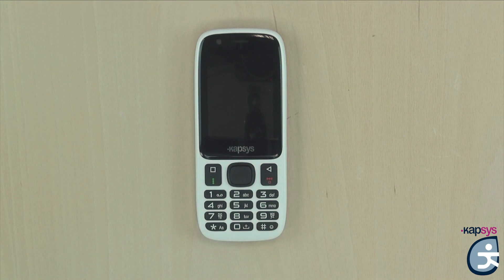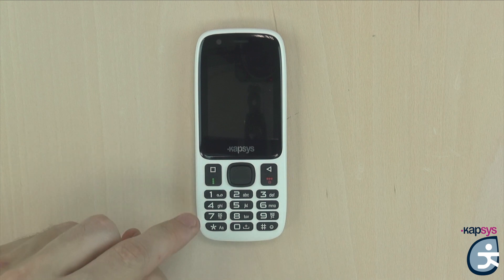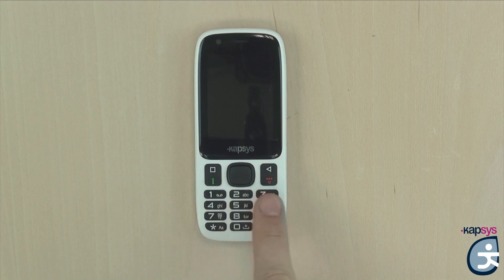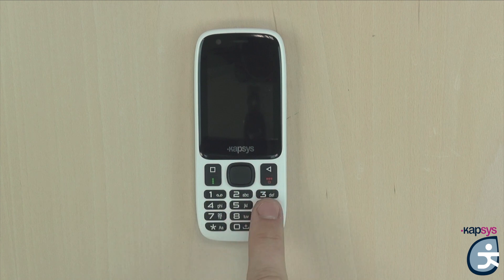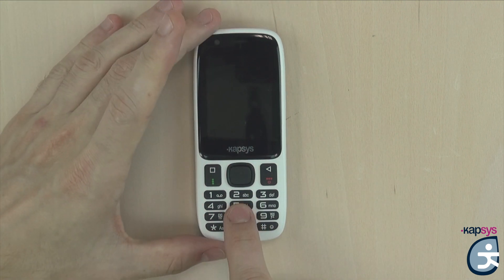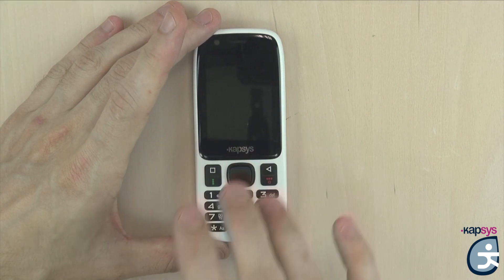Below the screen, you have the physical keyboard, which is composed of two parts. On the lower part, you have the classic alphanumeric keypad, including keys 1 through 9, star, 0, and pound. A central ergo dot is present on the 5 key to help you position your fingers and type text or phone numbers. Above that, you have the navigation pad with the central joystick.